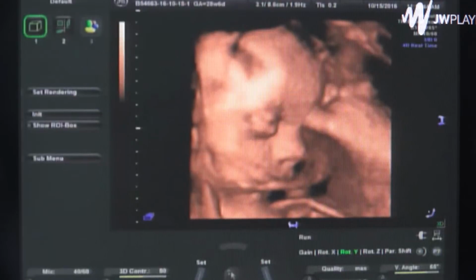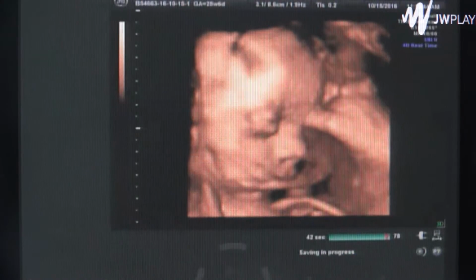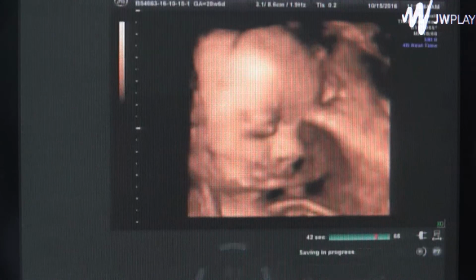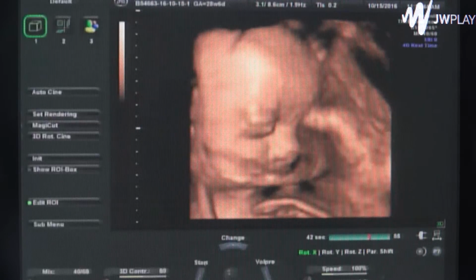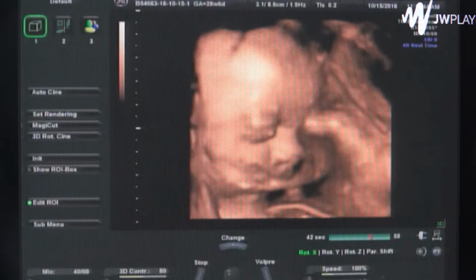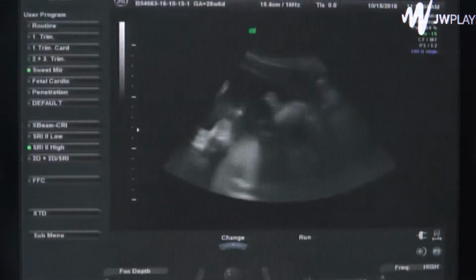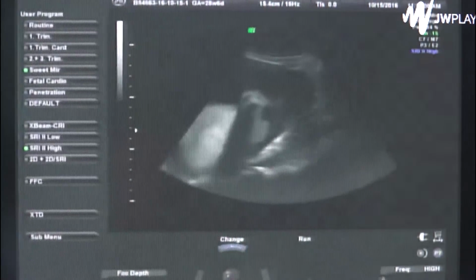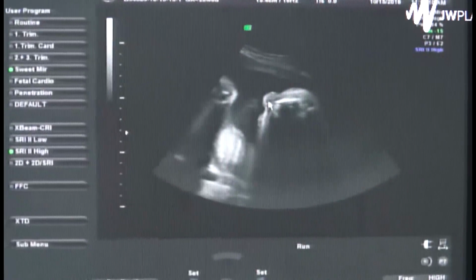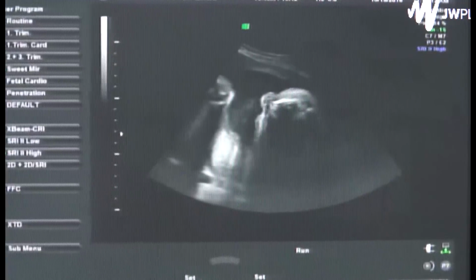Her hands are bent. Mm-hmm. So if we get her to move a little bit, could she get out of the way? She can, but she has to move it herself. I wish I could move it for her. That would be so great. But no, a lot of times they'll move around, especially with her little foot being out there. She's probably going to push it out of the way. Yeah, her whole foot's there. Let me come from this direction. Can you see her little nostrils right there? Mm-hmm.